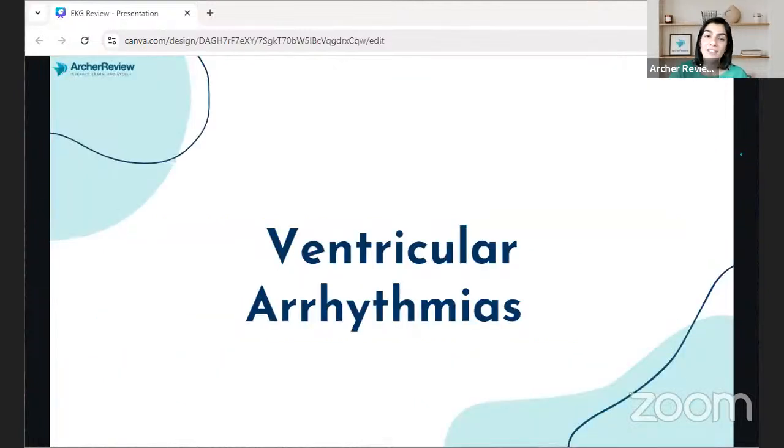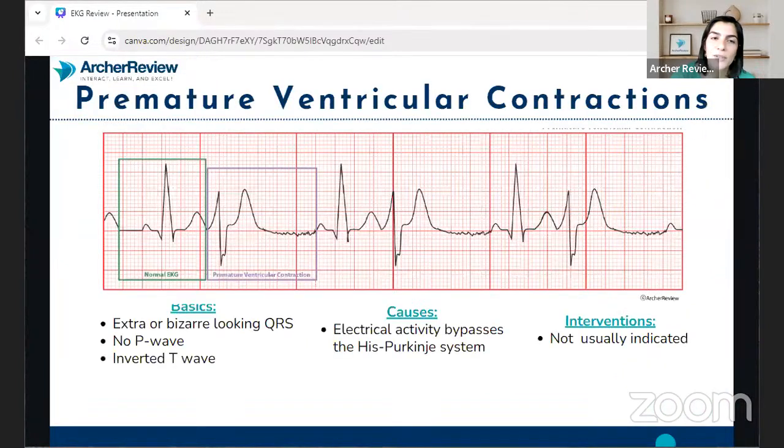Okay, so now let's jump into our ventricular arrhythmias. We're going to talk about PVCs, or premature ventricular contractions. I don't know why, but these seem to be my favorite. I think it's because they're totally benign and really common. Oftentimes patients will get really freaked out by it and they'll say, occasionally I feel like I have to catch my breath or take a deeper breath and then it goes away. What is that? Then you'll get an EKG and it'll be totally normal, but you can get that Holter on and they'll see occasional PVCs and you can talk to them about that.